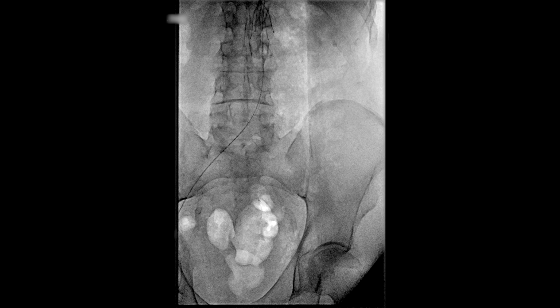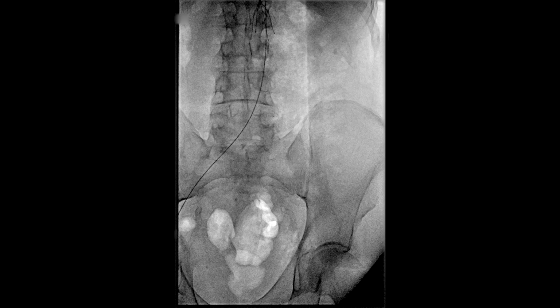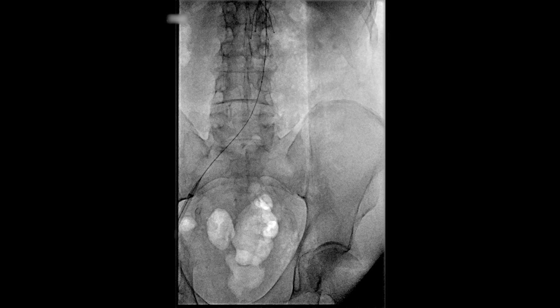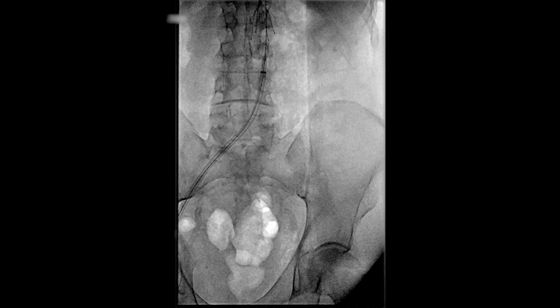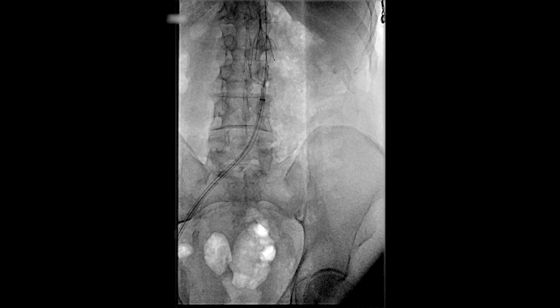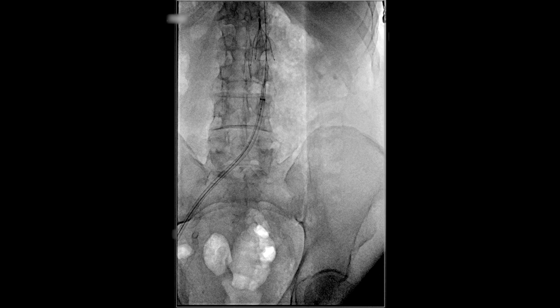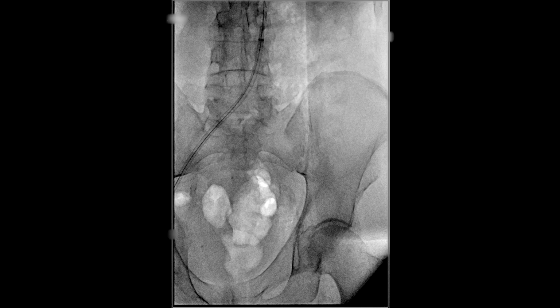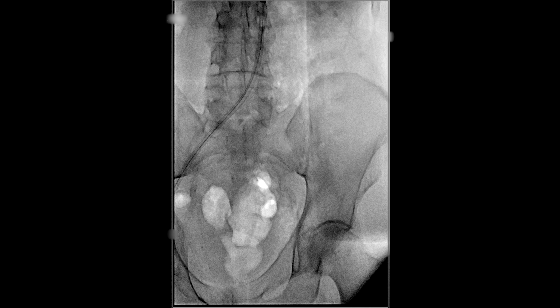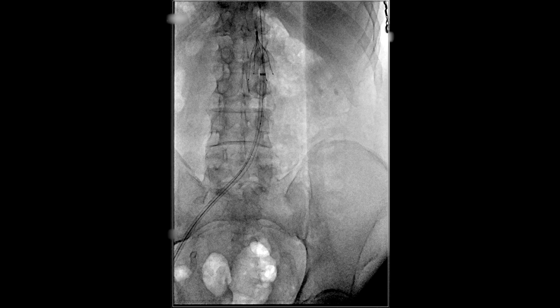After this is performed, we then move our wire up into the inferior vena cava and insert our T20 flow retriever to retrieve any thrombus that we may have accidentally liberated into the filter. We also want to repeat our injection at the site of the filter in order to ensure that we have clear flow through the inferior vena cava from both of our lower extremities.